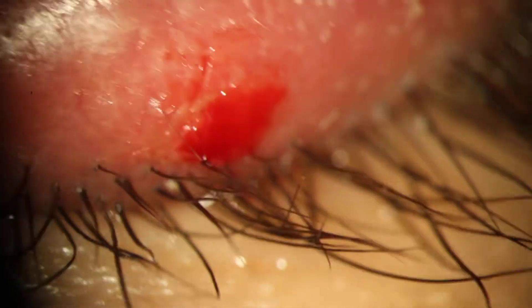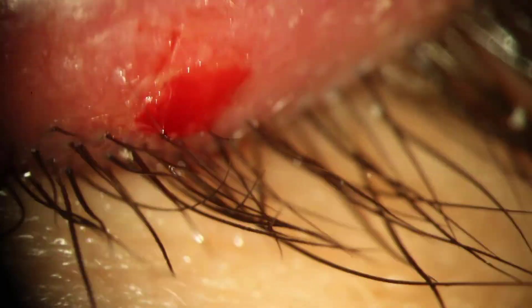I think most of what's left is clear, and so that should be able to resorb just fine. There we go — good, yeah, very good. Okay.